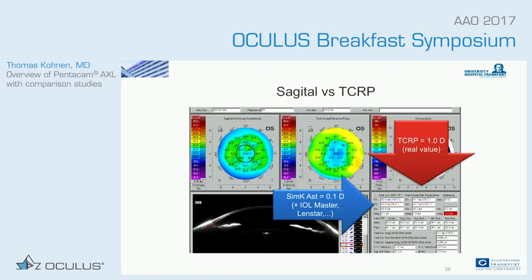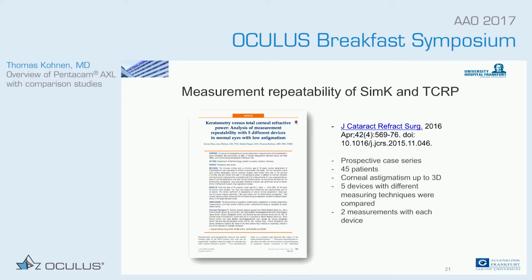And we have to evaluate this because, as we just talked about, the underestimation of the astigmatic component against and with the rule, I think this is very important. So we had here a difference of 0.9 diopters, and that would have maybe, we would have chosen, or we had chosen here, the lowest toric IOL available.